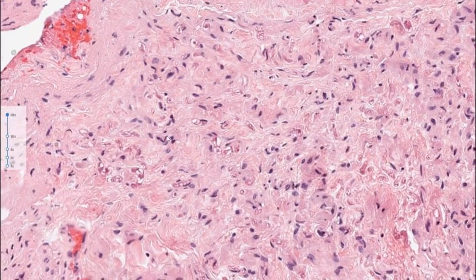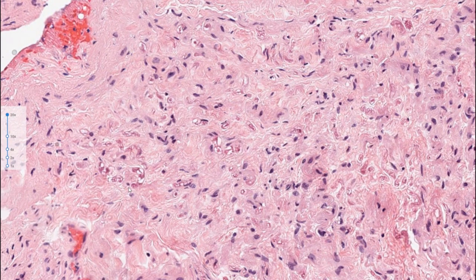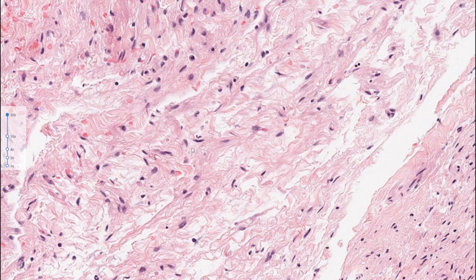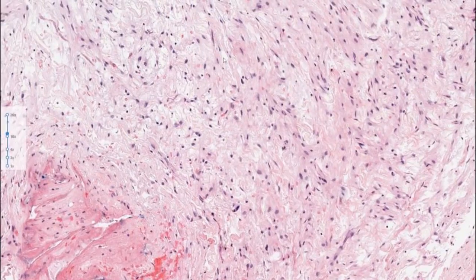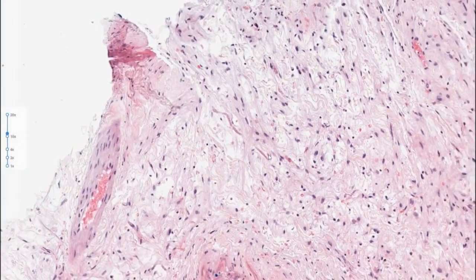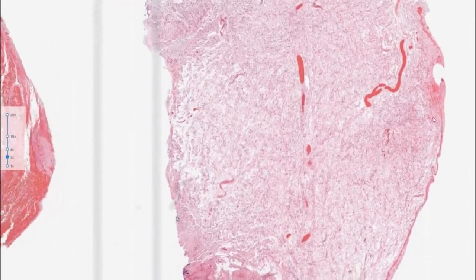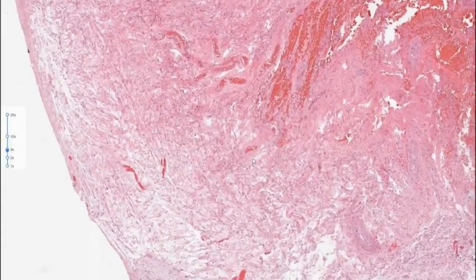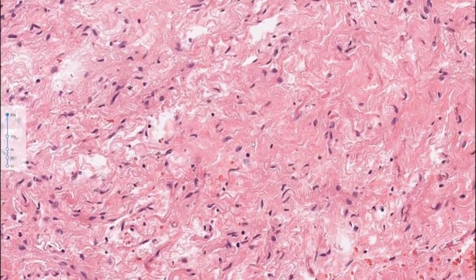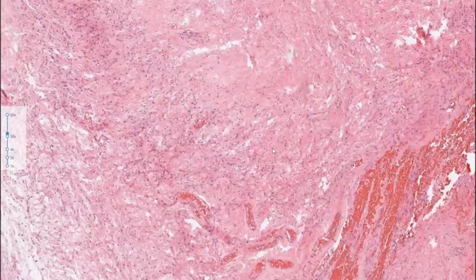Occasionally in the CNS, we have had cases that get mistaken for fungal hyphae, for example. So it's important to get acquainted with them. A few collagen fibers, not quite the shredded collagen that you see with your conventional neurofibromas, but certainly some of it makes you think of neurofibroma more than anything else. But a little bit of a heterogeneous appearance. Again, a few other axons. So in this case, immunostains were also performed, found to be helpful.